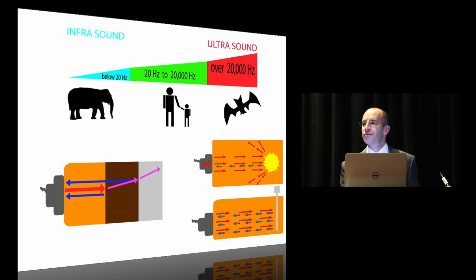So why is it called ultrasound? It's called ultrasound very simply because its frequency is higher than we, as humans, can hear. How it's generated is that you have a piezoelectric crystal on your probe, and you put a voltage through, and it starts to oscillate and creates ultrasound waves. It can detect differences in tissues because each tissue plane has a different penetration, reflection, and scatter.